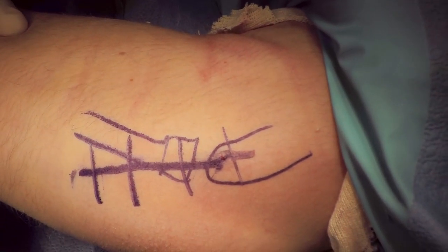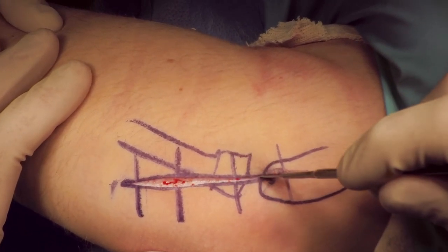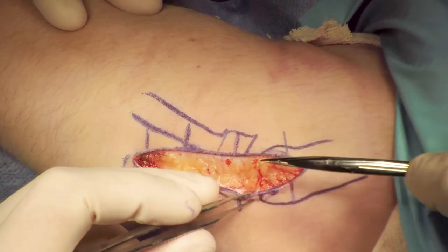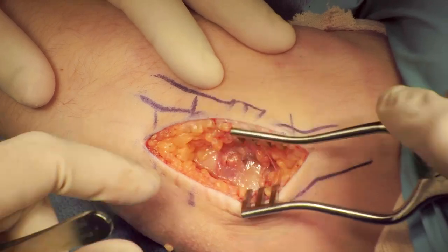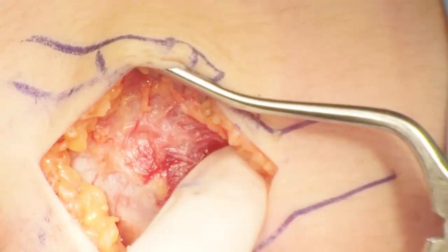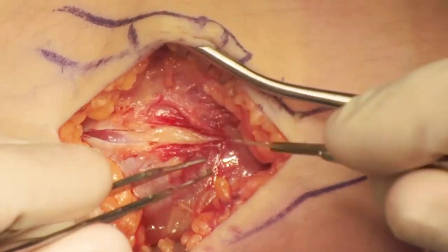With the patient in supine position, a Kocher approach was performed. The incision is made at approximately a 30 to 45 degree angle, going distally and posteriorly from the lateral epicondyle. The dissection is taken through the subcutaneous tissues down to the fascia. Most of this dissection can be performed with a self-retaining retractor. The incision is then made in the fascia in line with the skin incision, extending distally and posteriorly.